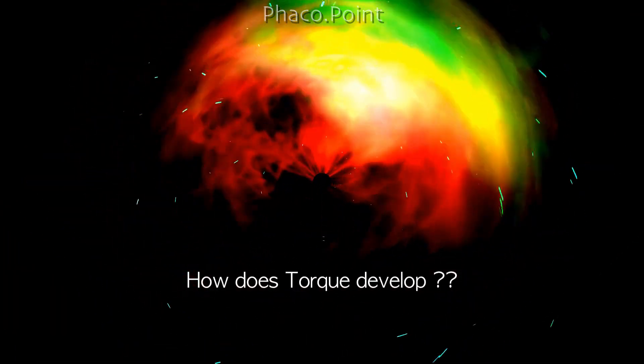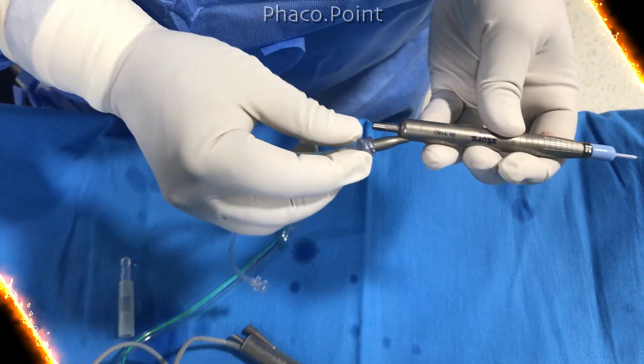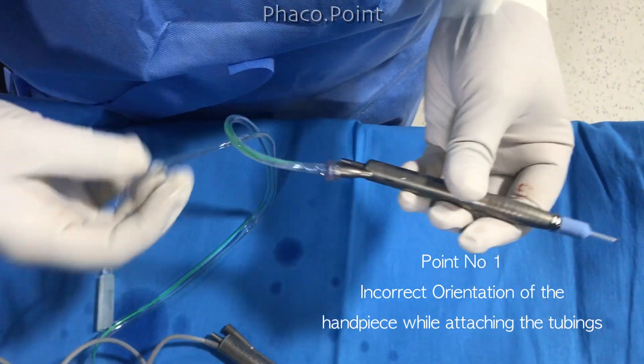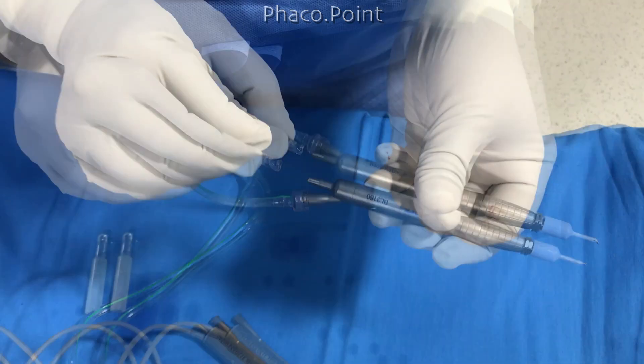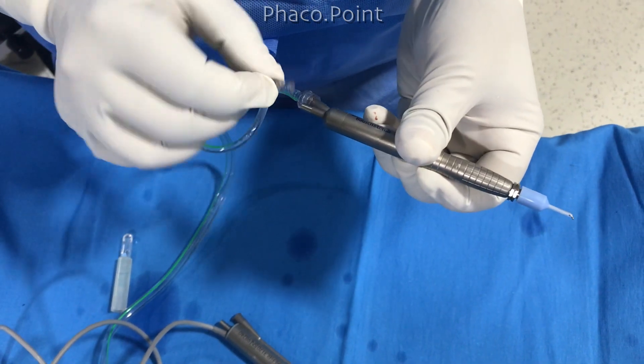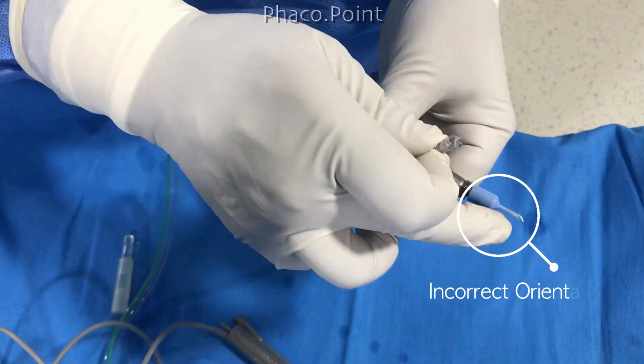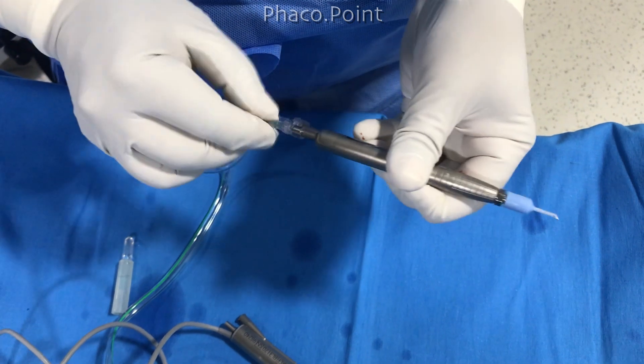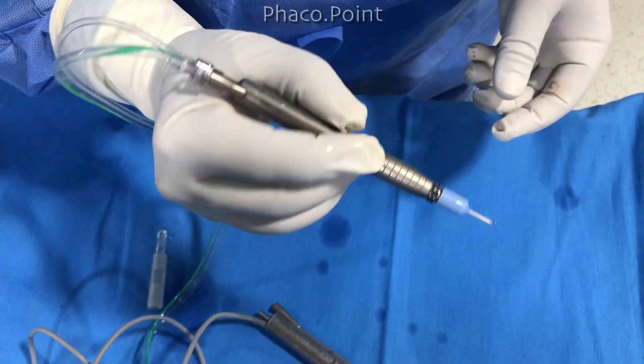Now how does this torque develop? The first important step is that you have to hold the handpiece in the correct orientation before you attach the tubings. In this particular case, the handpiece is facing in the wrong direction and the orientation is incorrect. If you attach the tubings in this position and then right the handpiece and hold it, you can generate a torque.